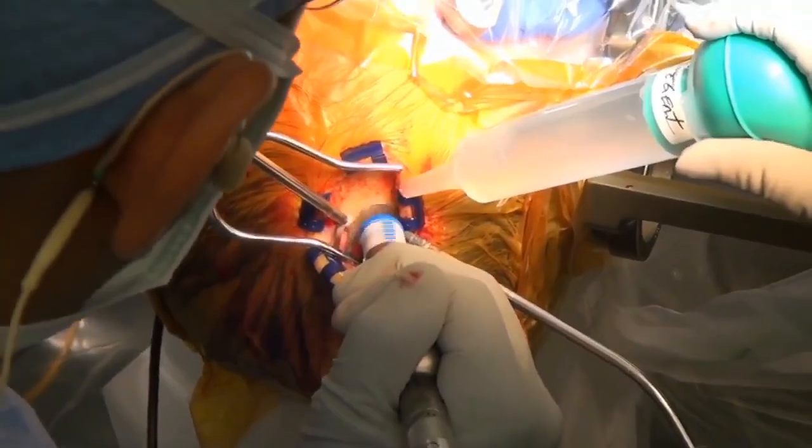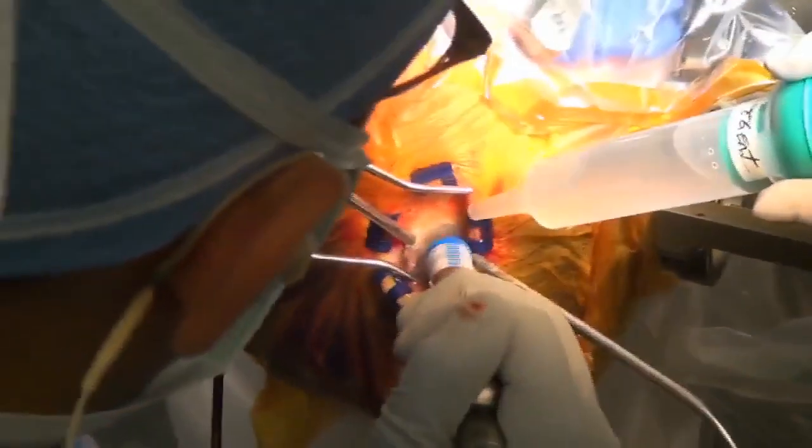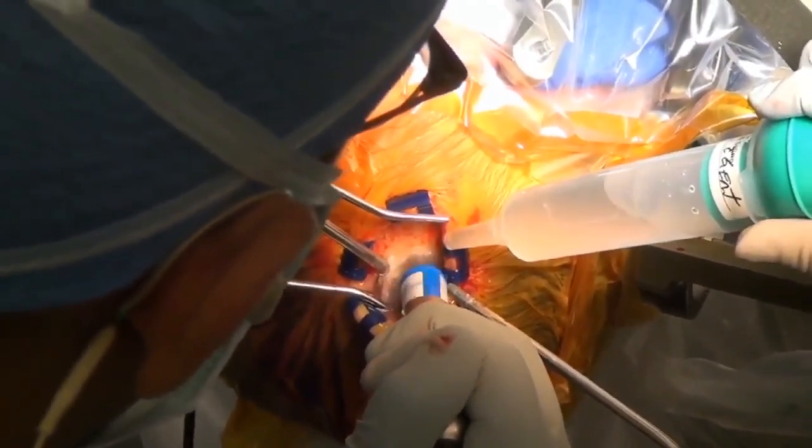The little sound right there is the inner table. We're right about at the end, and then stops on its own.